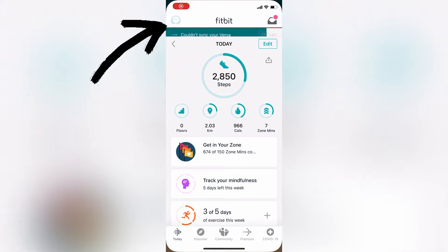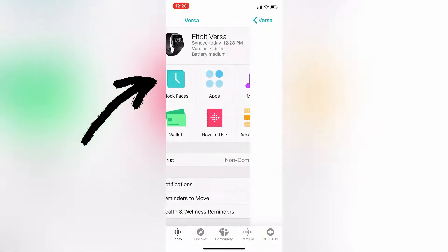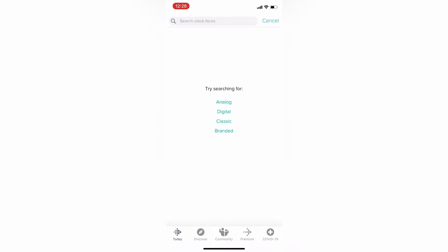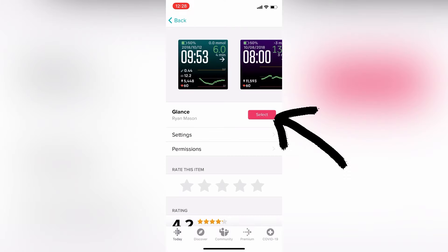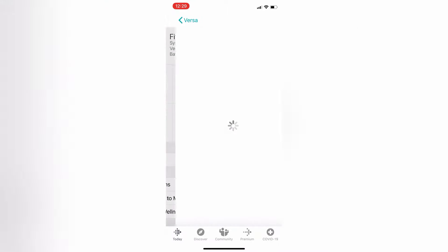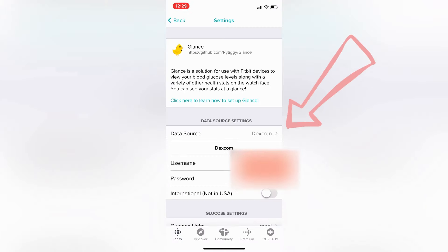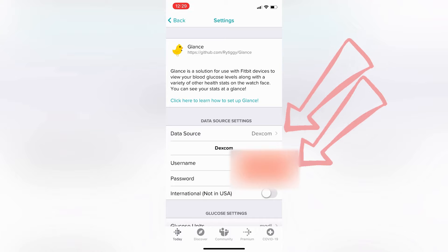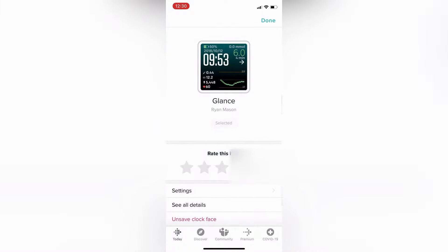I had to delete Glance first and then reinstall it, but let me show you. Open the Fitbit app, click the little person icon in the top left corner, then click Versa. That takes you to the device page — click Clock Face, then in the top right corner select All Clocks and type in Glance. Hit search, click the first result, then click Select to download the clock face. Click back, click Clock Face again, and now you can see your clock face listed — click it, then click Settings. Here you select your data source. I selected Dexcom — I blocked out my username and password, but you enter those here. Just type in the same username and password you use for Clarity, and that's it — you're good to go.